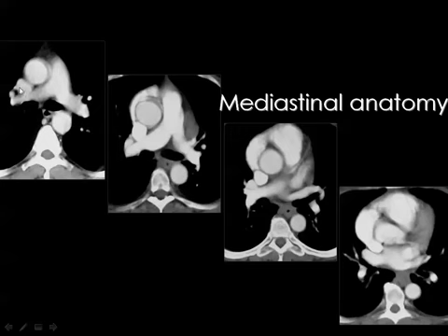And this is the superior vena cava, and here is the beginning of the right atrium. This is the superior vena cava that has entered the right atrium. Then this is the pulmonary artery. It will enter the right ventricle. It has entered the right ventricle. And this is the right ventricle, and this is the right atrium.